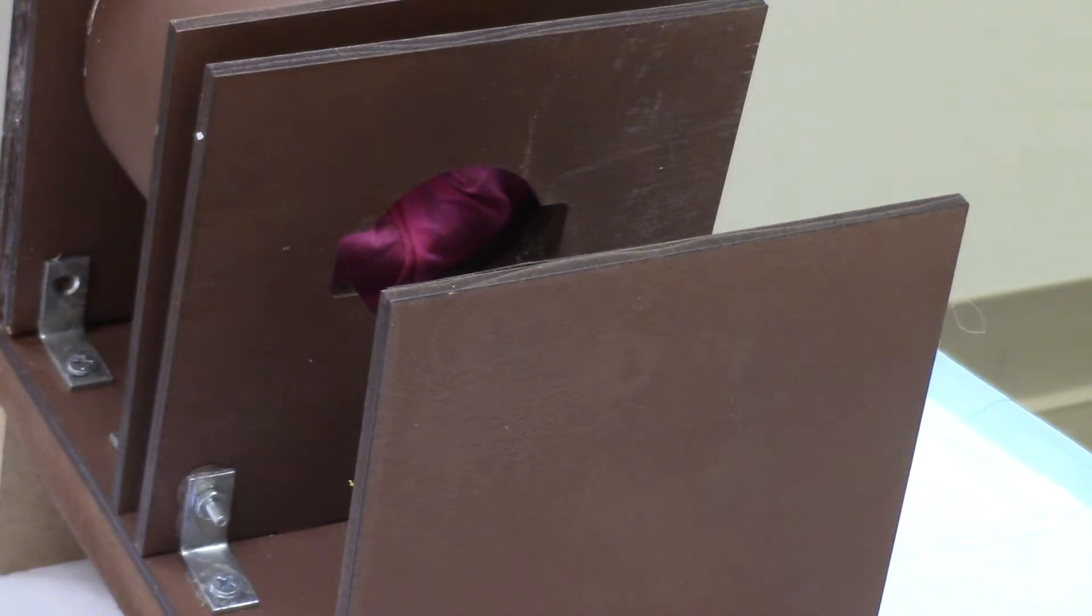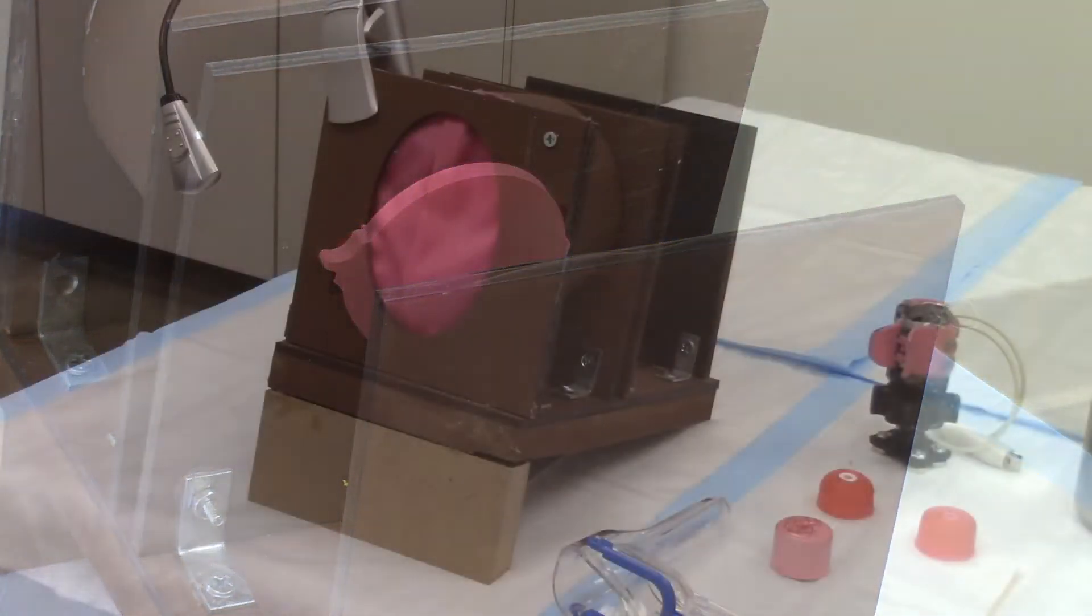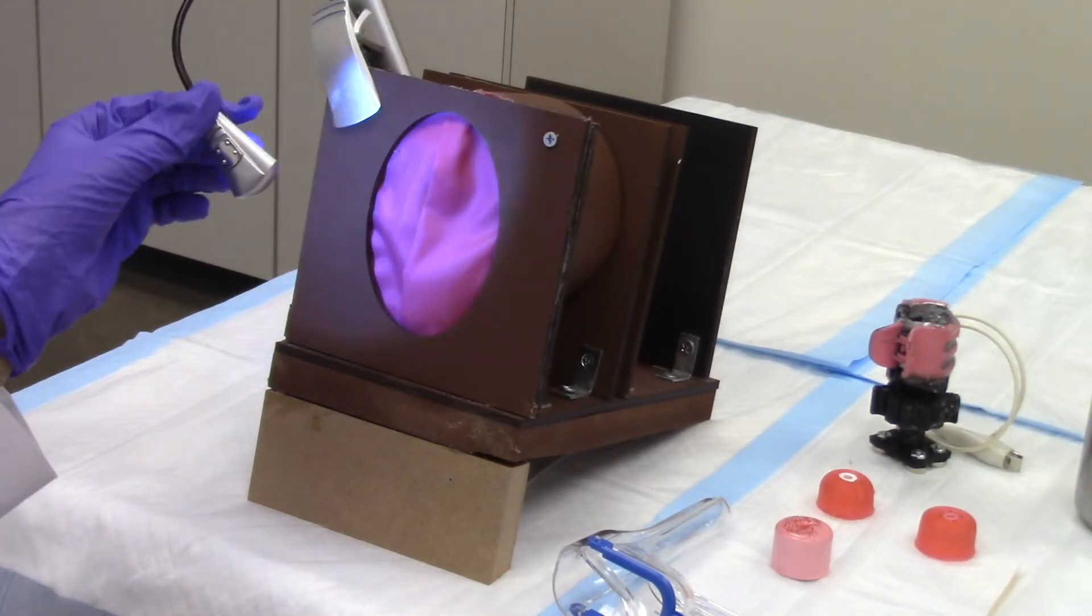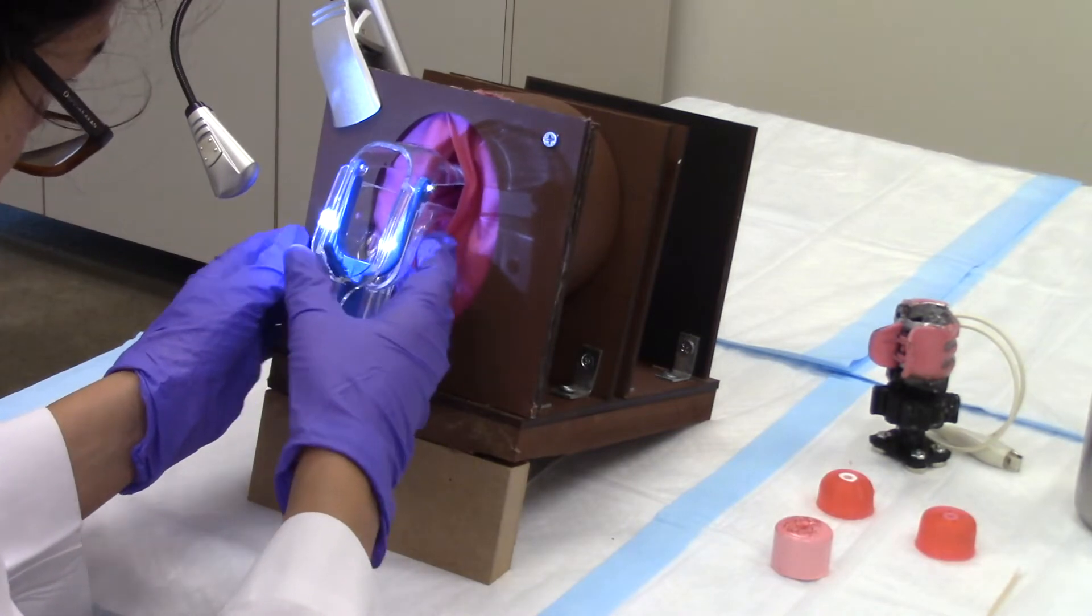Once the model is in the holder, the holder can be installed in the back of the pelvic frame by twisting and locking in place. Once the cervical model is in place, the plastic speculum is inserted into the pelvic frame and opened to visualize the cervix.